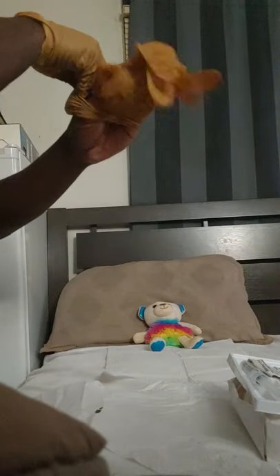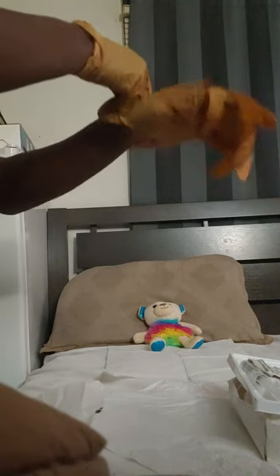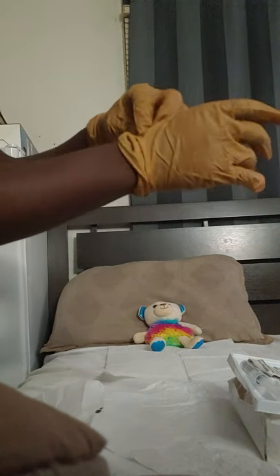Slap my hand in. Fix all the flaps. Since my hand is sterile, I can fix my glove by going inside.